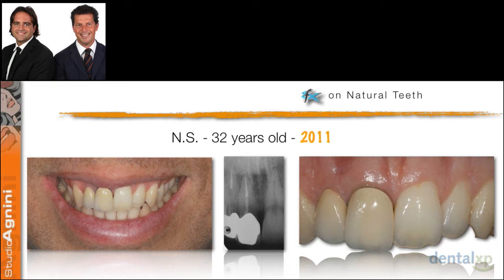You can see the 7 and 8 restorations, PFM restorations with several aesthetic issues. For example, the midline was canted. He was complaining about the gray of the final PFM restoration. He was complaining about these gingival asymmetries that were not exactly the same as on the contralateral side. And of course, this was a tough patient because we are discussing with a patient with a nice smile line.